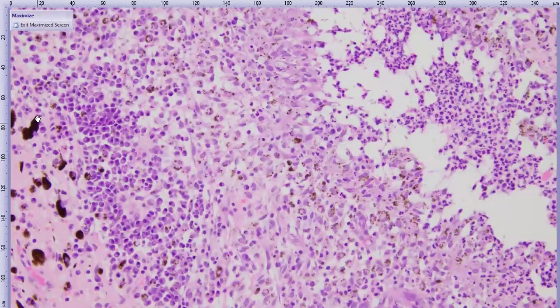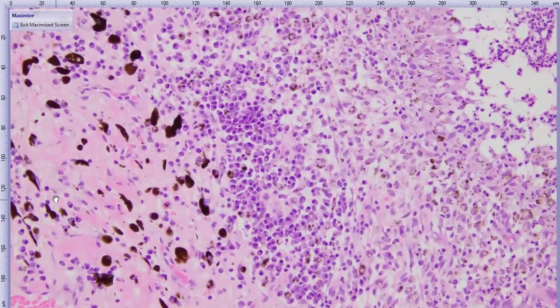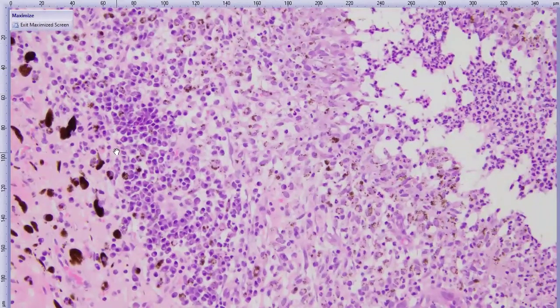So the uveal stroma itself more or less ends way over here. If you don't believe me, you can nudge slightly that way. So uvea is here. And then all this stuff on top of it from here to here is fibrovascular membrane. You can see these little tiny vessels here and there. That's infiltrated pretty heavily by inflammatory cells, lymphocytes, plasma cells, macrophages. And then on top of that membrane, there's this multi-layer carpet of epithelioid macrophages. So these are macrophages here, and then they're associated with neutrophils. So this is our epithelioid macrophage carpet, which is a key diagnostic feature of this condition.